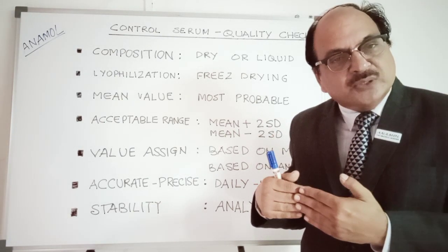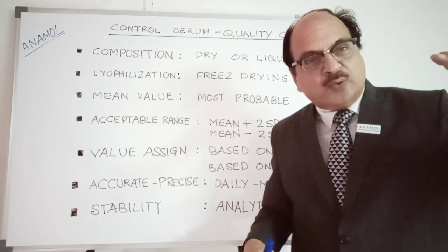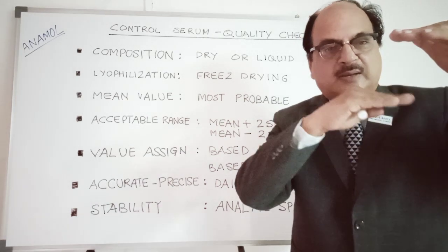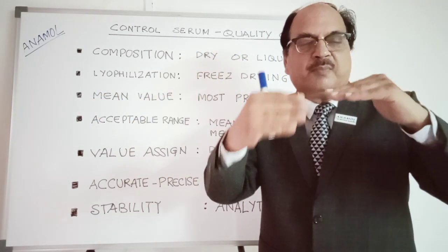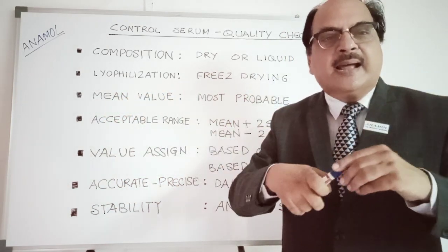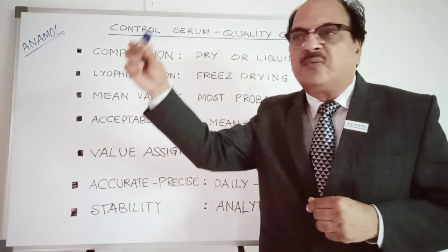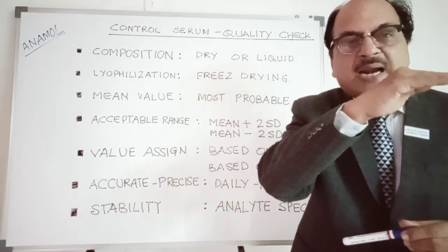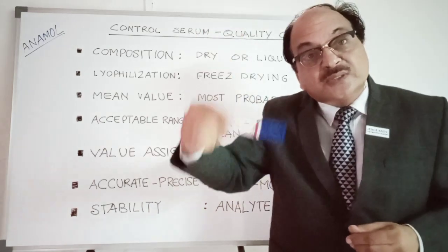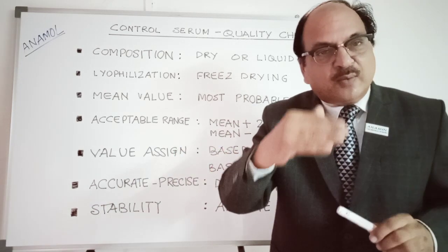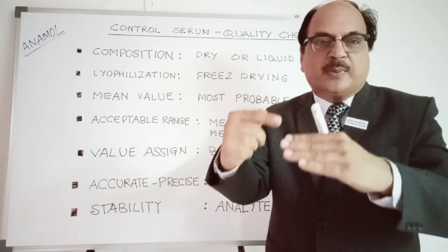Precision is reproducibility. If I use a control serum of a certain lot and my HDL value is 50, and I continue using the same lot every day for 30 days, do my values consistently fall in the same range or do they fluctuate too much? To monitor this, I plot a Levey-Jennings chart: the mean value in the center, upper and lower ±2 SD lines on the y-axis, and days on the x-axis. I plot my daily HDL control values. If values gradually drift down each day, I need to recalibrate; if they fluctuate too much, I need to standardize lab variables. If values consistently stay within ±2 SD, results are worth reporting to the clinician.